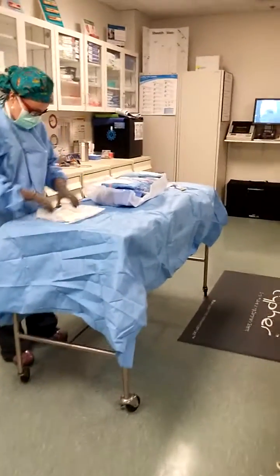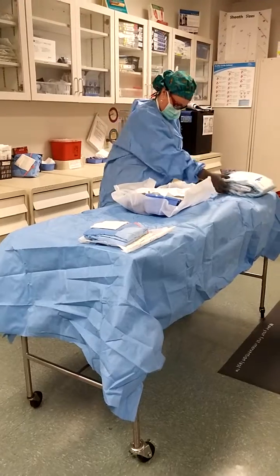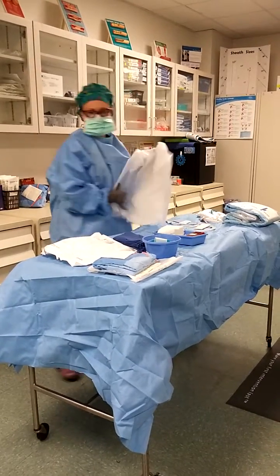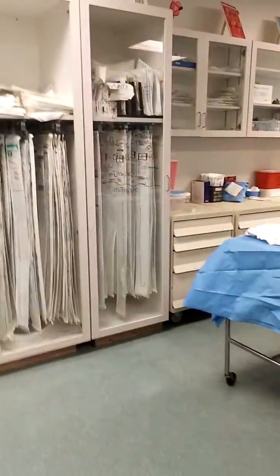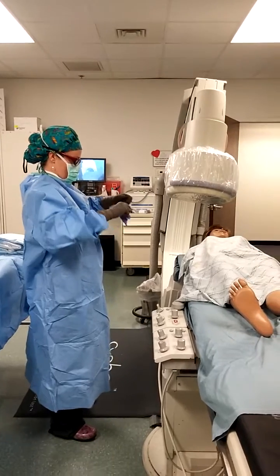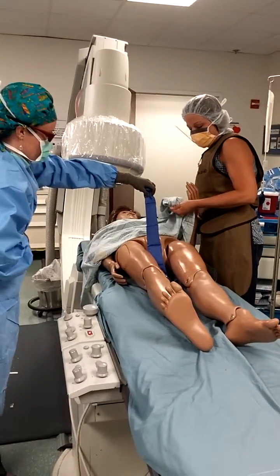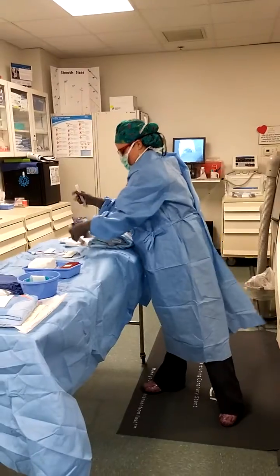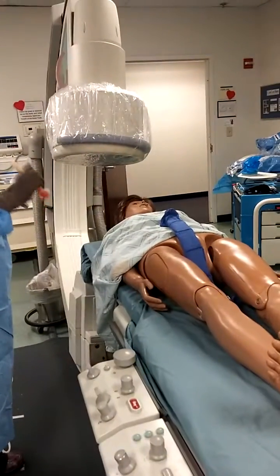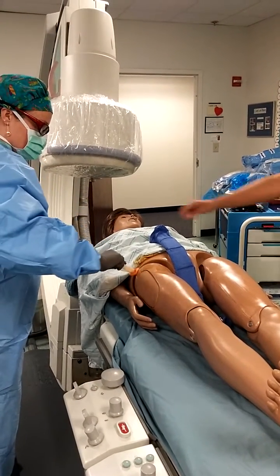I note that my circulator is possibly waiting on me, so I'm going to speed it up a little bit. Okay, so I'm not going to fiddle too much with my stuff. Okay, we're going to take your covers up. Alright, Miss Susie, we're going to wash off with some cold soap on both groins. It's going to be cold and wet. It's going to sting a little bit too, okay? Just keep your hands right by your side, and if you need anything, thank you so much.